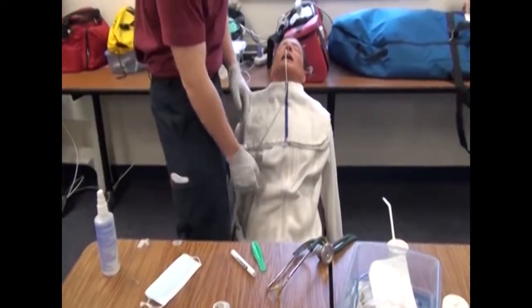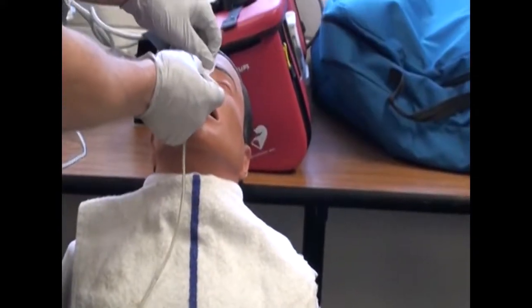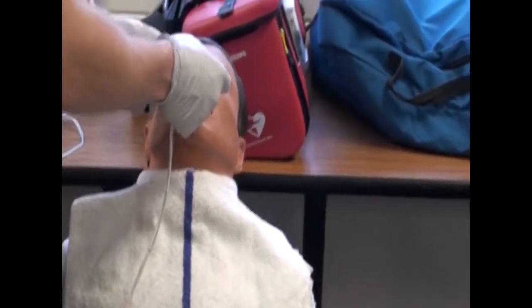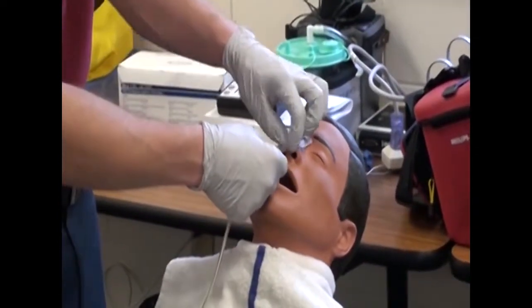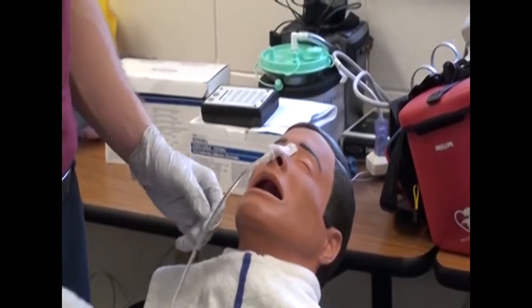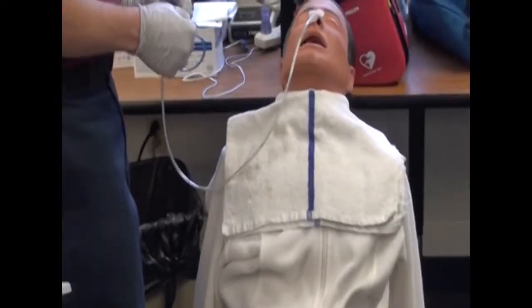Split 4-inch piece of tape lengthwise 2 inches. Place unsplit end over bridge of nose and wrap strips around the tube as it exits the nose. Then you're going to fasten the end of the NG tube to client's gown. Just pin it where the... Pin it to the gown and provide slack for movement.